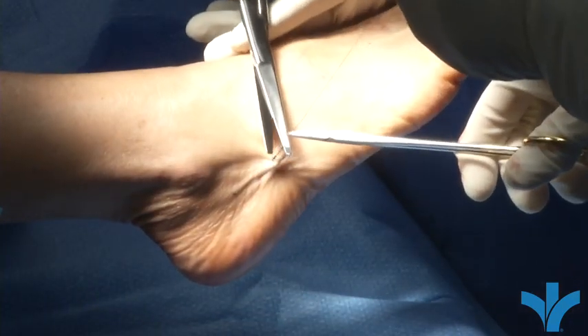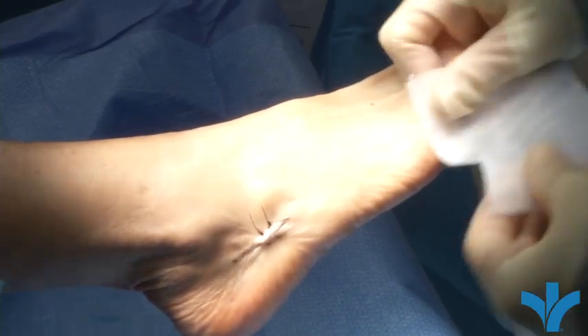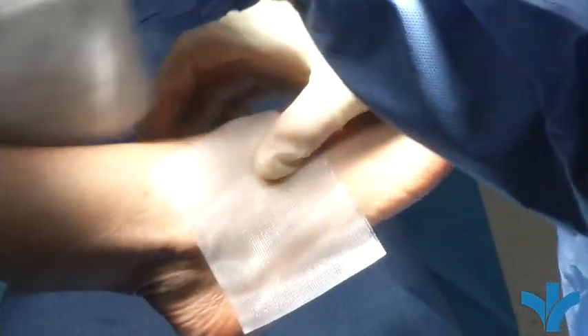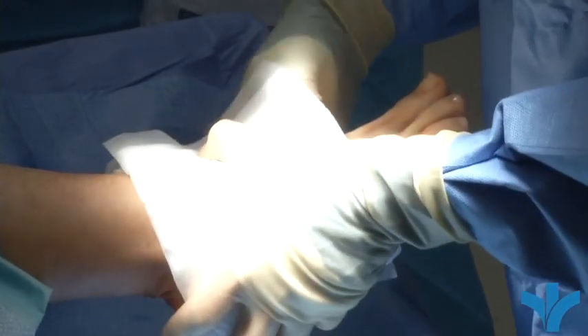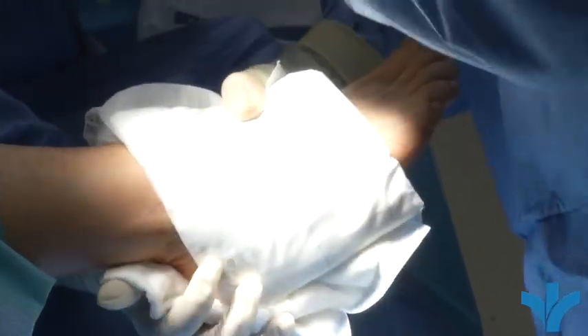You can see the two stitches in there. We put a soft sterile dressing on there in the operating room, and we don't want the patient to take it on or off — it stays there for two weeks unless it gets wet. Then we put what's called a splint on, which is a soft cast. It's got a hard component to the back of it, but it allows the patient to swell if they have any swelling, rather than putting a full cast on in which there's no room to swell.